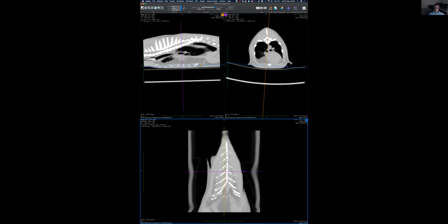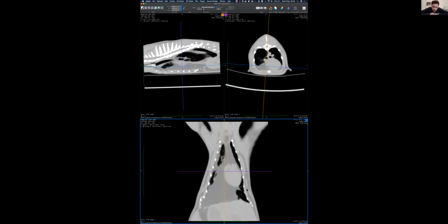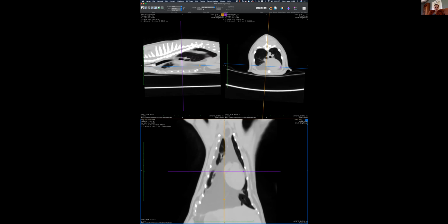And now we see the increased opacity on the right hemithorax. What is that? Fat. Yes. And that now solves all the problems. Make sense? Now having fat there, if we come back to the radiograph, I'm happy to do that.